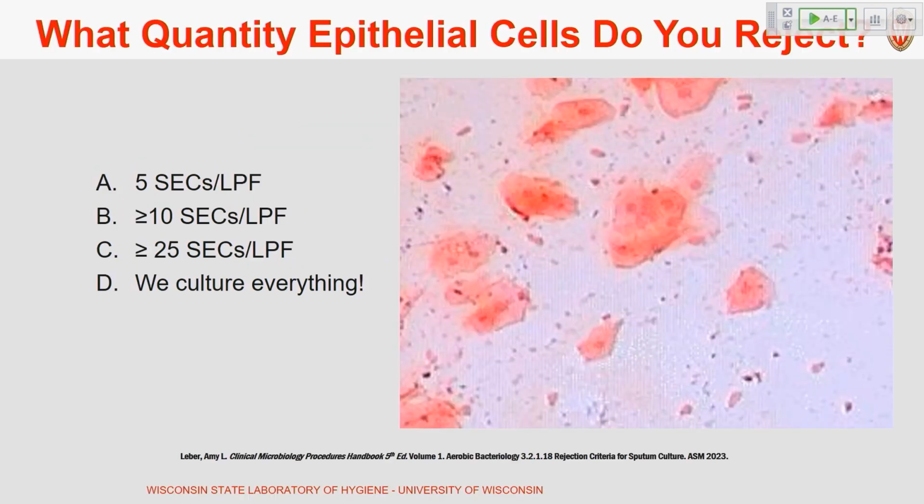So, a clicker question here. Looking at a sputum submitted for Gram stain, what quantity of epithelial cells do you reject? Please enter your answer.